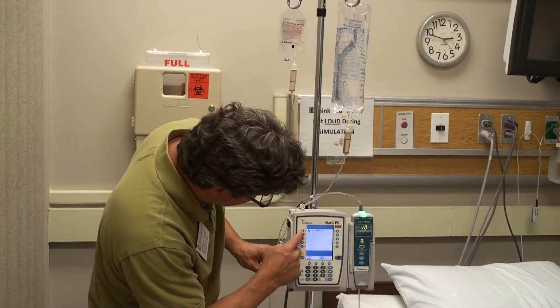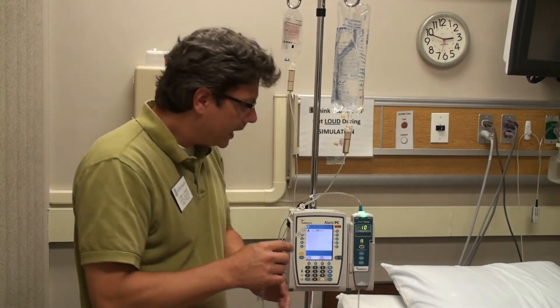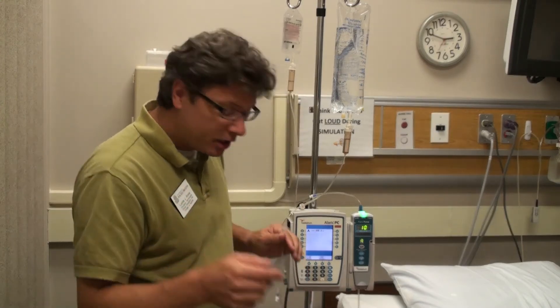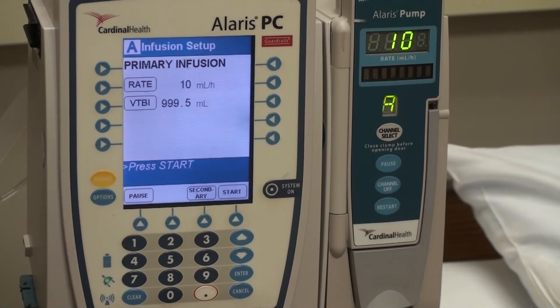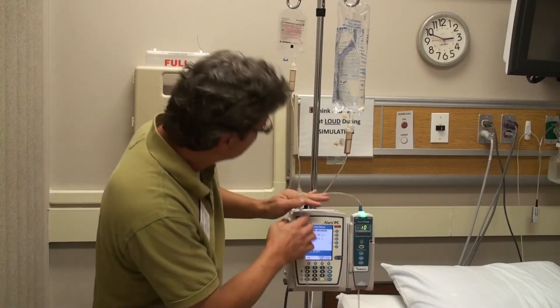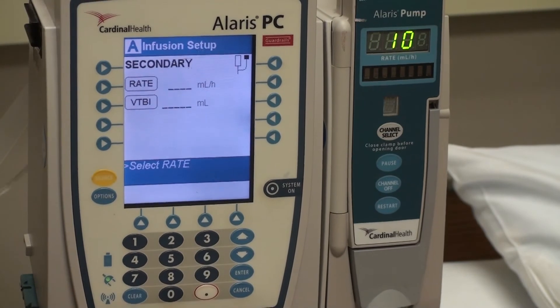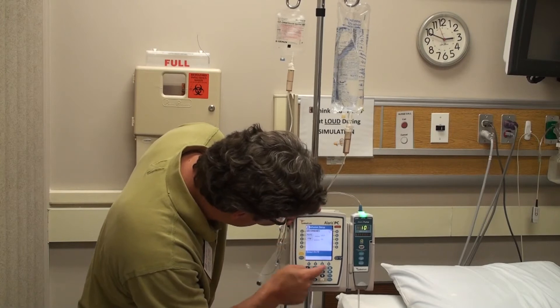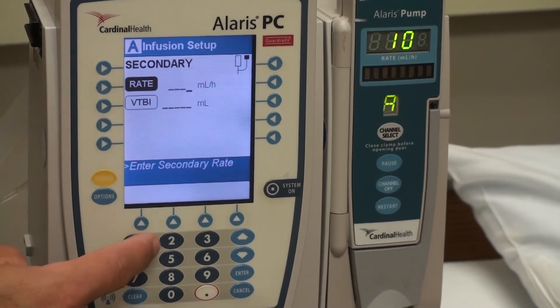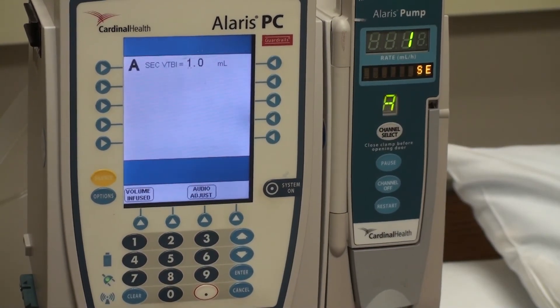You're going to use these buttons here to select the options that the menu gives you. If you need to add a secondary line, you can come back over, click channel select, and then you'll see a secondary line option here. I have a secondary line up here — you can click secondary, and it's going to have a rate system for you as well for that secondary system. We can enter something small just to show you how it works, then hit start on that. And that's your secondary line.